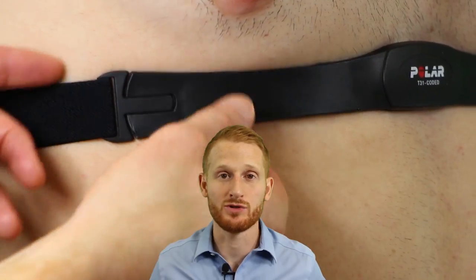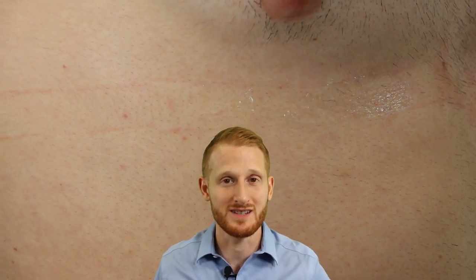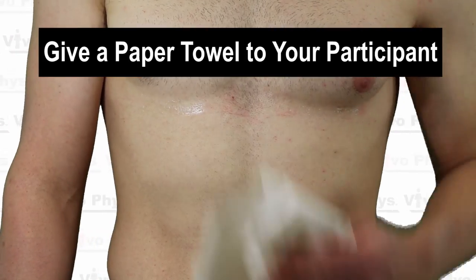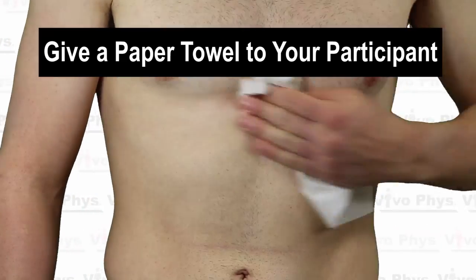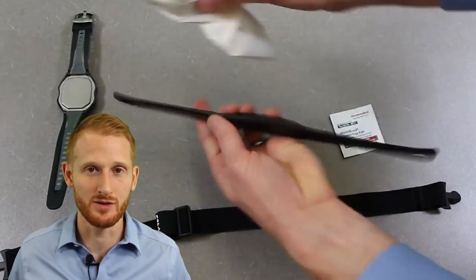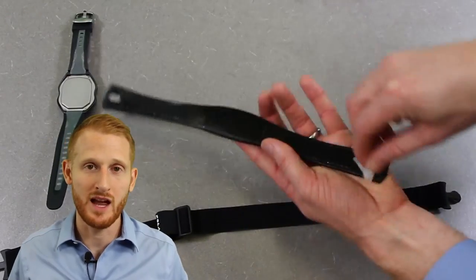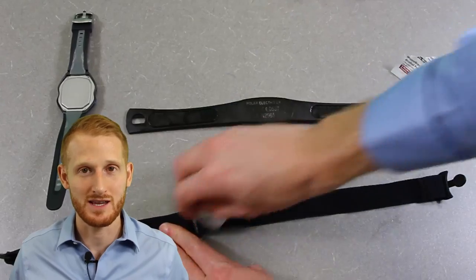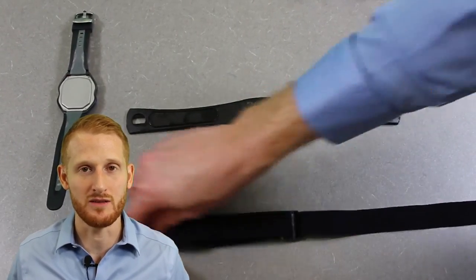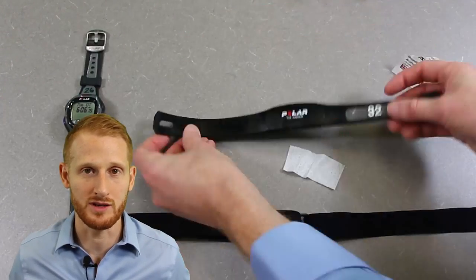At this point you can go ahead and have the person exercise or do whatever type of testing you're going to do using the heart rate monitor to measure heart rate. When you're all done, make sure you remove the monitor from the person — so they don't accidentally walk away with it — and clean the heart rate monitor thoroughly. Take it off the individual, wipe it down with paper towels to remove any sweat or residual gel, then take alcohol swabs and clean anything that was in direct contact with the individual.